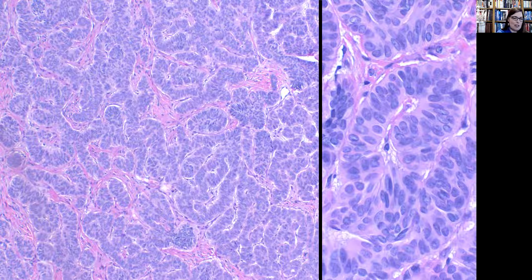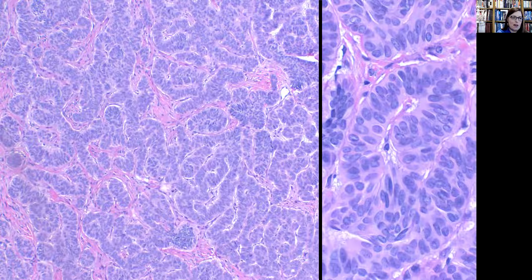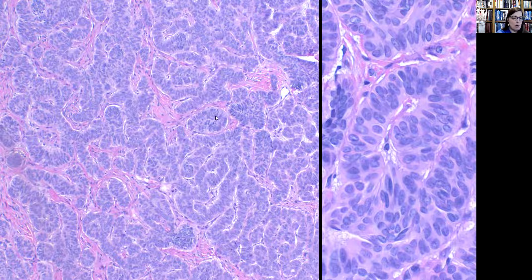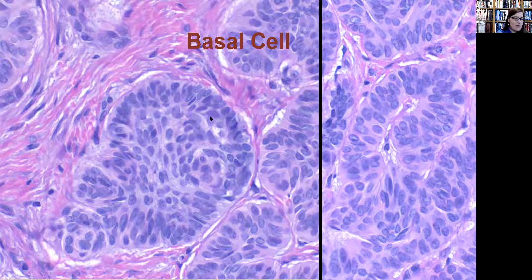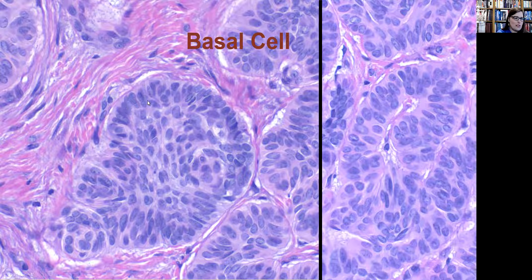The basal cell variant can be alarming because the proliferative index is the highest — the highest Ki-67 is seen in the basal cell variant. This might lead you to consider an atypical ameloblastoma or ameloblastic carcinoma, especially since mitotic figures may be present. However, it has more strands and cords, is more basophilic, and has its own kind of unique palisading. At higher power, there are different nuclear features as well — a very different look from conventional ameloblastoma.